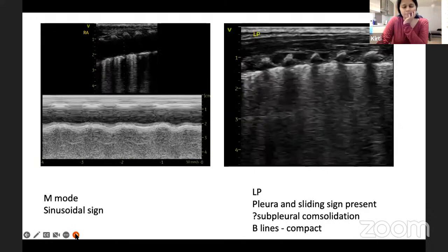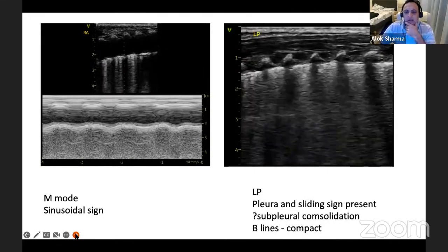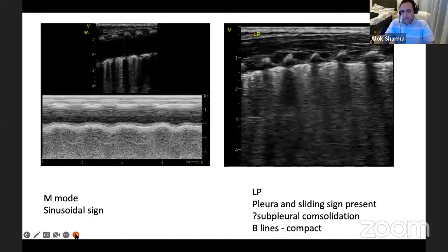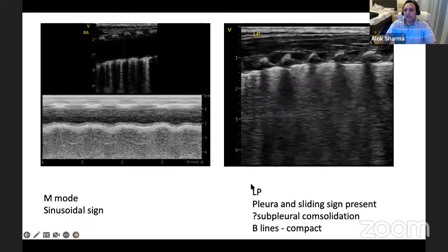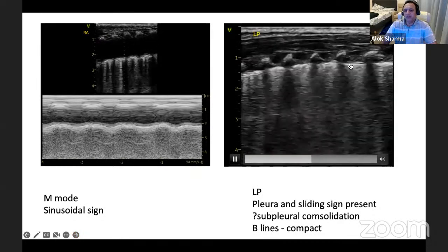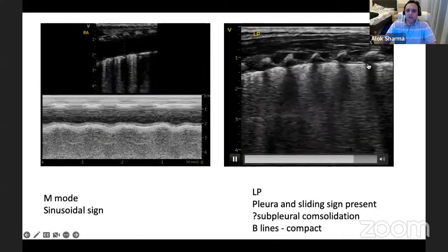You're using a Sonosite. So again, the GE and the Sonosite don't tend to have a focus button. The reason for that is you could see the image is nice and uniform throughout in the left posterior region. You've got minimal pleural effusion there. You can just see a small dark area there where the visceral and parietal pleura are separated. But again, what you've got is very good sliding.